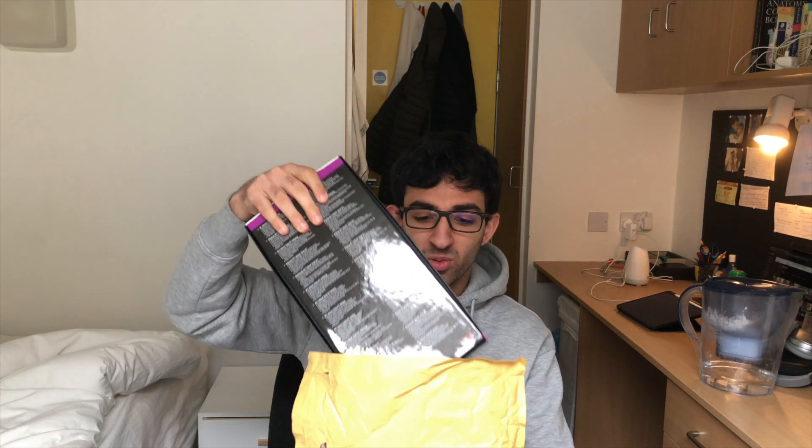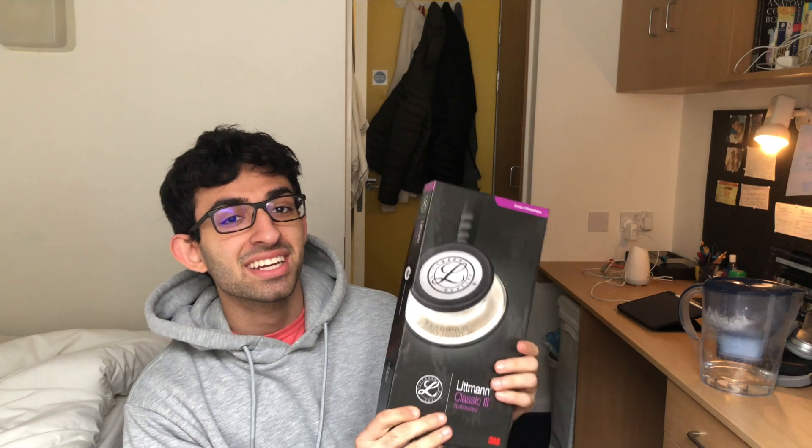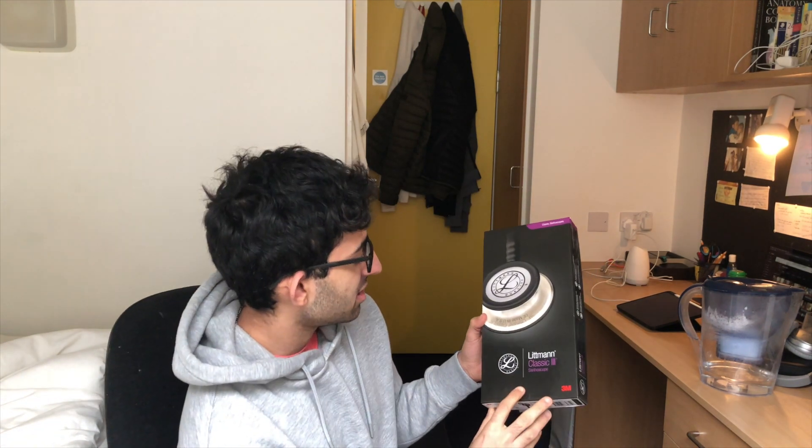And here we have it. Whoa, look at that. So it's the Littmann Classic III stethoscope, which is the one that is recommended by my medical school, by King's. I'm really excited. This is like the identity of a doctor, of a medical student, and it's a landmark moment getting this.